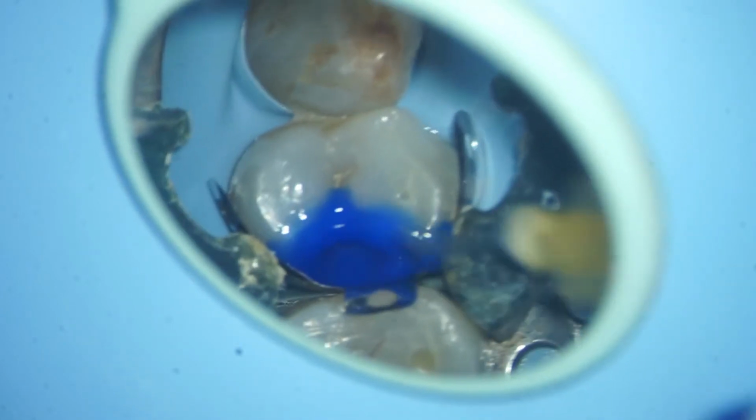So we are etching the tooth. We leave it for a few seconds, wash it, and now apply the bonding agent. The beauty of the rubber dam is that we can clearly focus on the work in hand and there's no interference from the patient. So after applying the bonding agent, we cure the bonding agent.